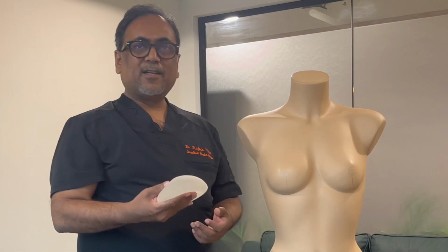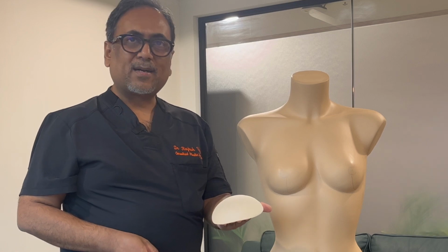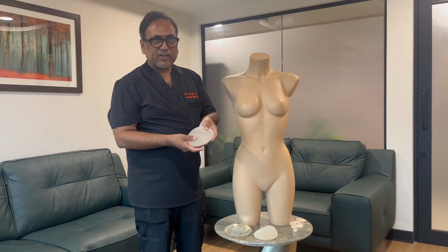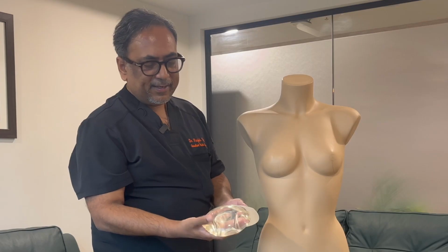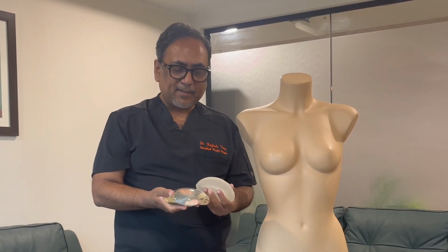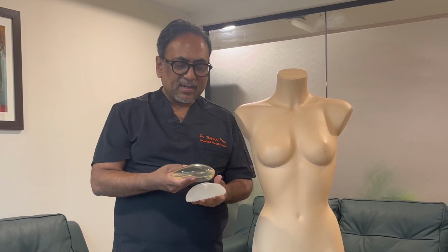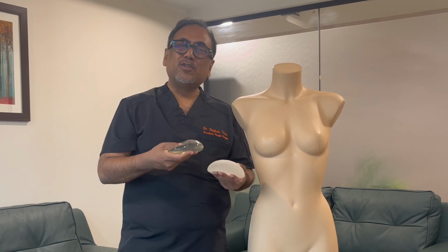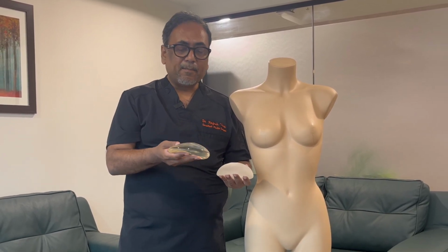This is a round implant that is most preferable by us in our practice. You can see this is a round implant, and it is textured. So you have textured implants as well as smooth implants. Now it has been proven that the association of anaplastic large cell lymphoma, although the incidence is very rare, is negligible or even nil by using smooth implants.